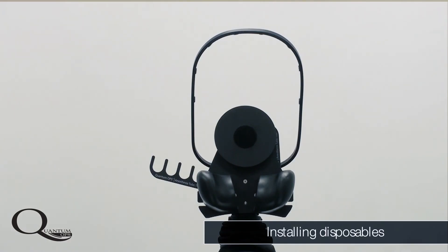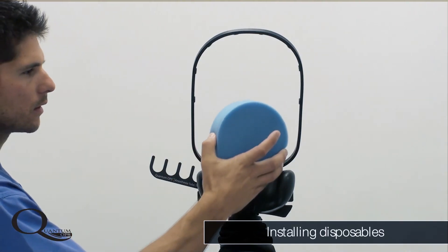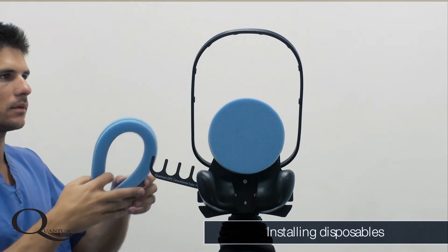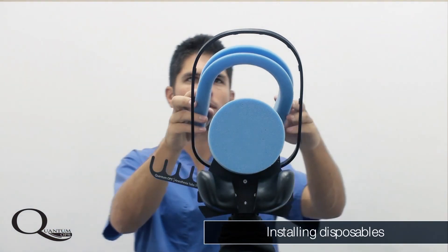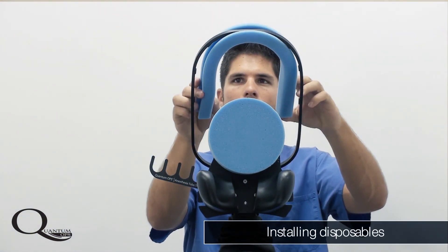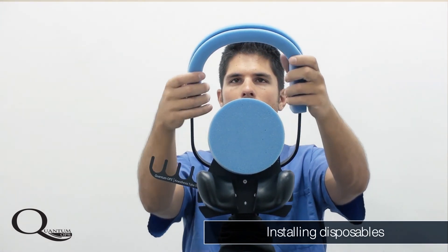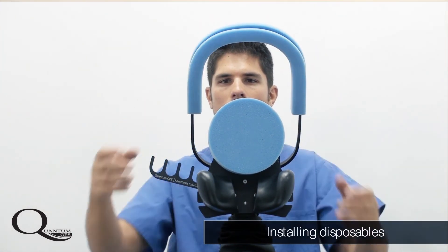New disposable pads should be installed before each procedure. Included in your disposable kit are a head pad, a halo pad, an arm pad, and covers for the backrest, laterals, and neck pads. These are quickly and easily installed and this should be done after the positioner is on the bed, before the patient is brought into the room.